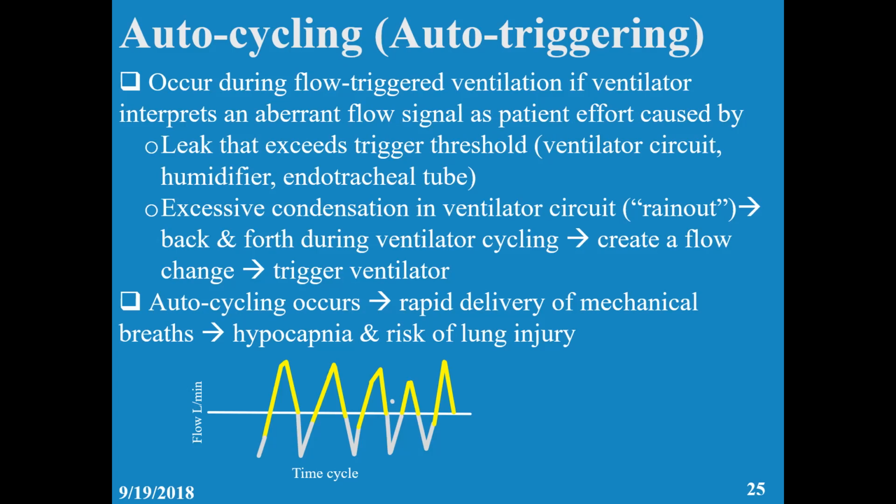And because it becomes very rapid, you will wash out CO2, and once you wash out CO2, you cause hypocarbia, and once you cause hypocarbia, you cause less flow to the brain, and you cause PVL and brain damage. Because it's frequent, you might cause lung injury too. Clear?